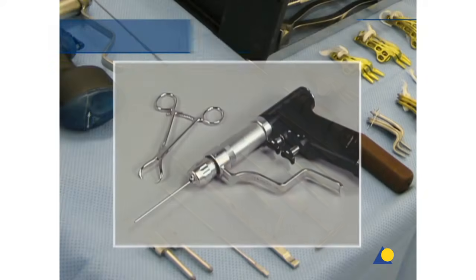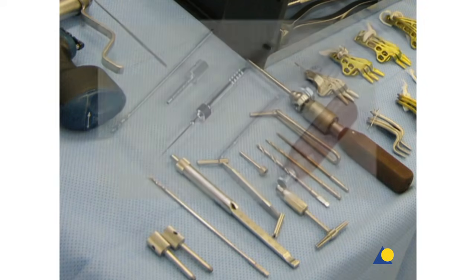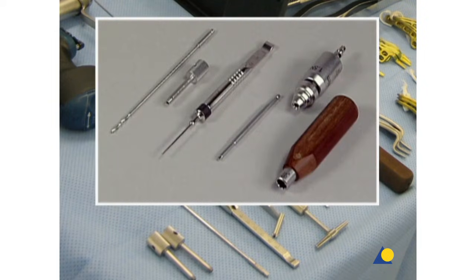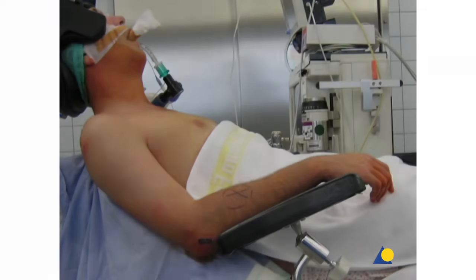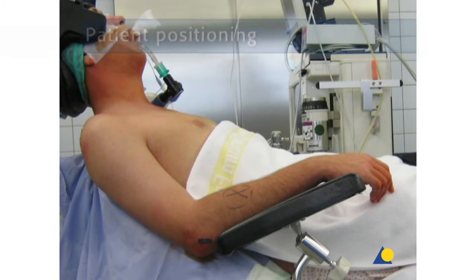For the preliminary reduction, a power drive and K-wire are required. For the fixation of the plate, the standard LCP tool set is used. The patient is placed in the beach chair position. Care is taken to position the neck correctly. A proper position of the cervical spine in all planes should be provided.